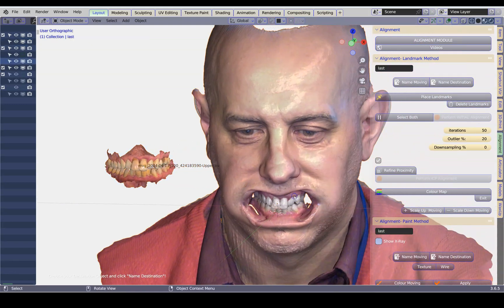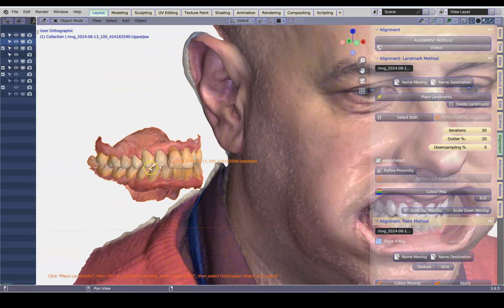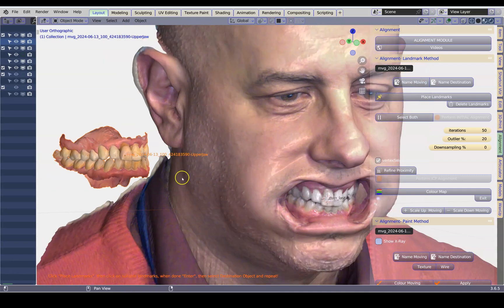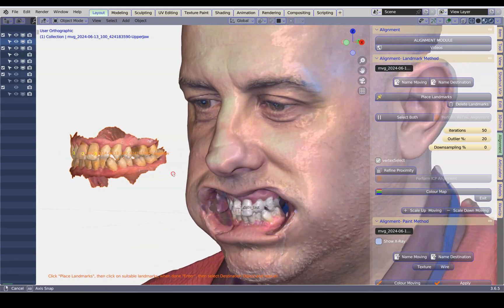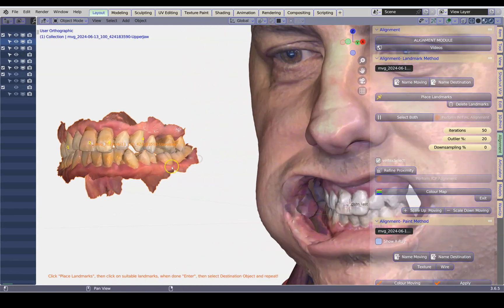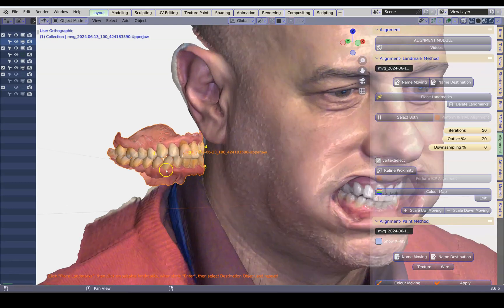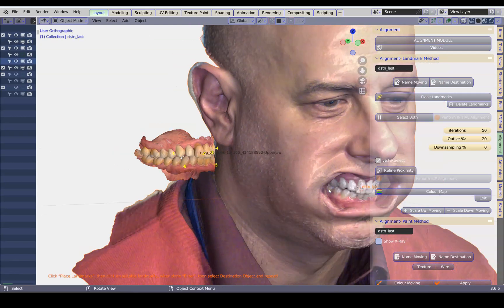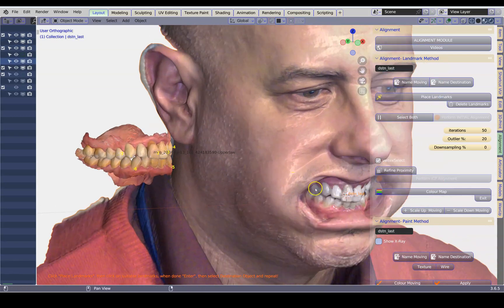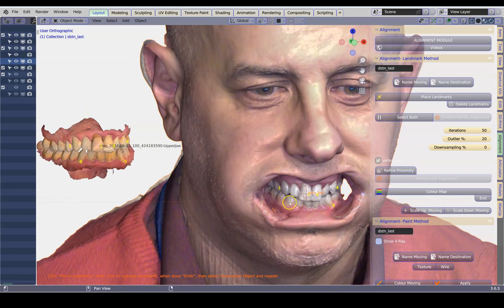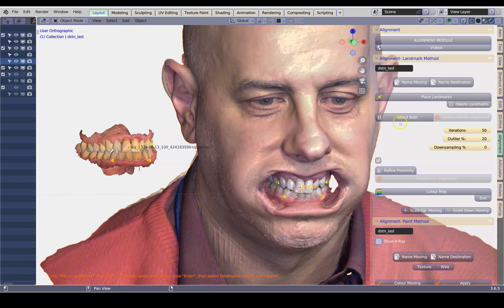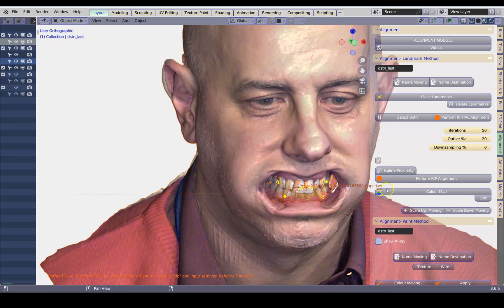We're going to place a few landmarks. We can see over here what teeth we can use — we've got a little bit of the premolar over there. I'm going to put one on the front two teeth, go back to the canine, another one on the lower canine, and another one on the other lower canine. Click enter, select this one, place landmarks, and do the same thing — please get the order correct. Based on that, I'm going to click enter, select both, perform initial alignment, and then perform ICP alignment.